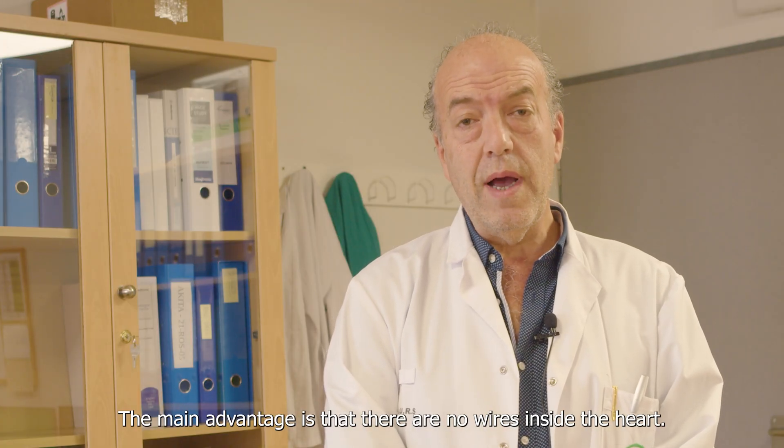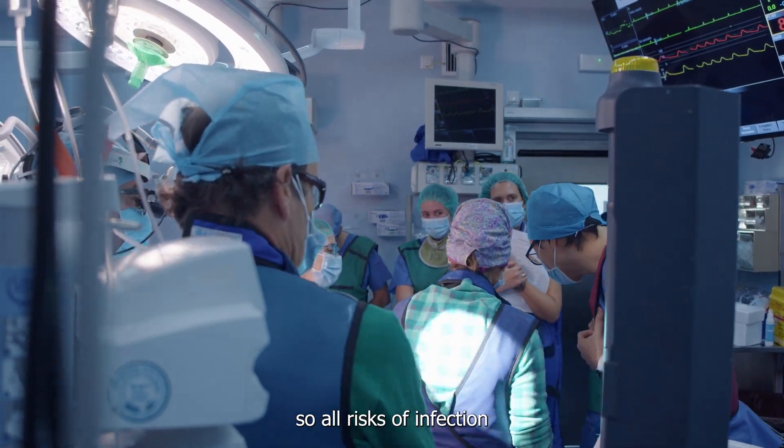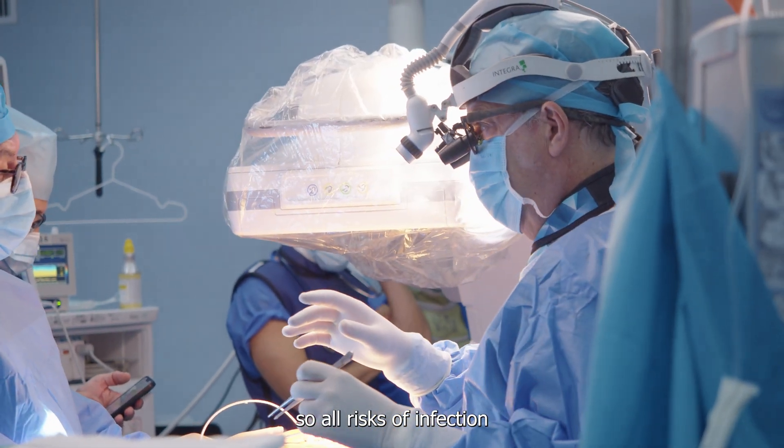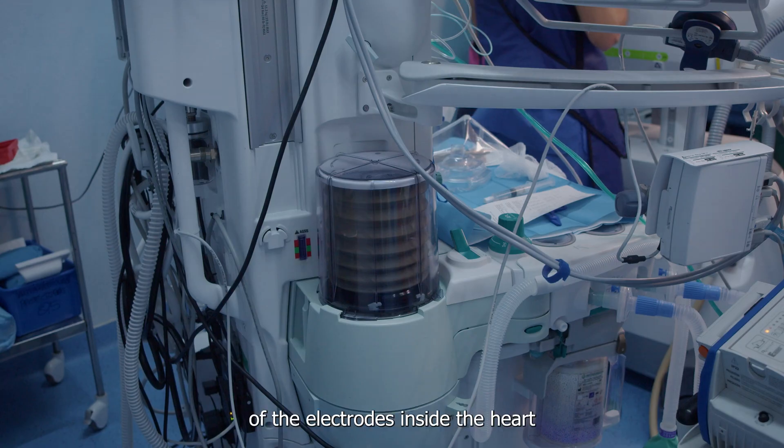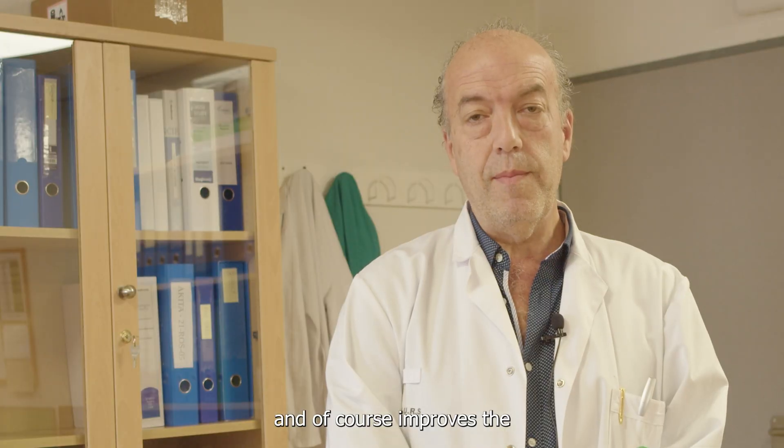The advantage is that it does not have any cable inside the heart — the vascular tree is completely free — so all the risks of infection of those electrodes inside the heart are minimized, and of course it improves the possibility of defibrillation at a lower dose.